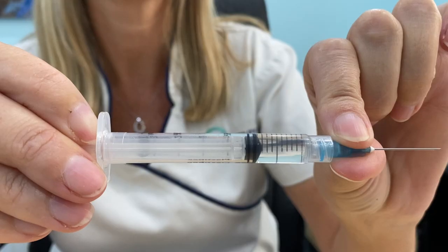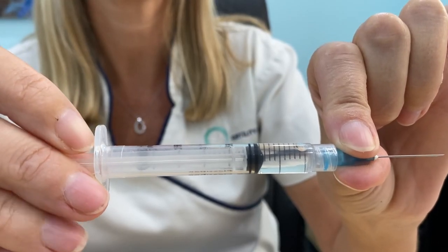When you're ready to do the injection, uncap your needle and hold it like a little dart or a pen. Wipe the area with the alcohol wipe and then pinch a nice firm bit of tissue. When you pinch the skin, dart the needle in firmly. Hold your needle at the coloured side, and then with your other hand, pull back ever so slightly on the plunger. You'll see a little air bubble — you know you're in the muscle — and just push on the plunger nice and firmly until all that medication is injected, then pull your needle out. Give it a rub afterwards as it helps distribute the oil through the muscle.